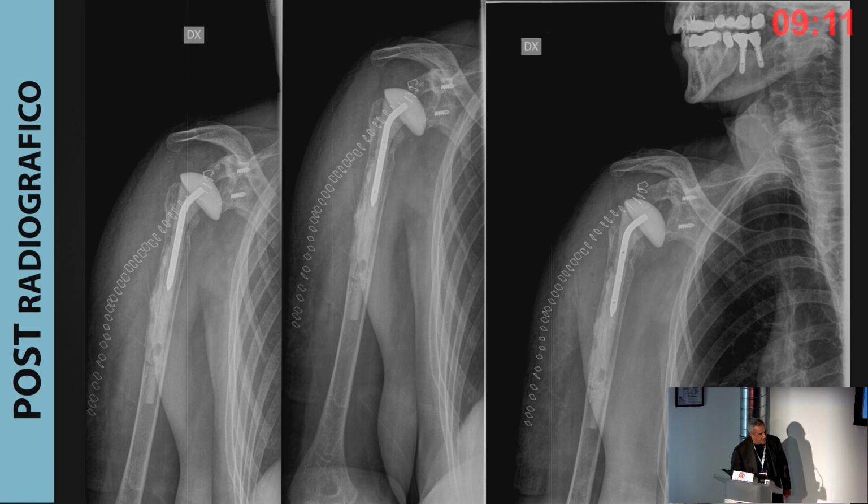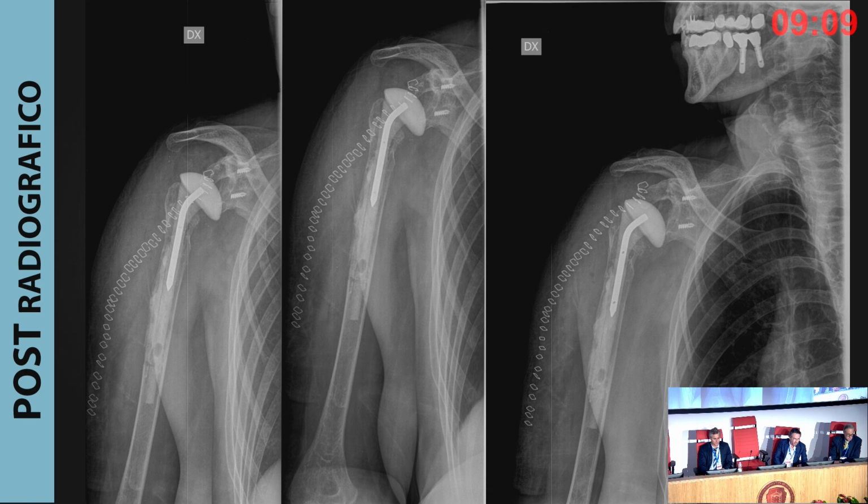Are you satisfied with this X-ray, or would you expect something different? I am extremely satisfied with this X-ray, especially because it's yours and your patient. But I think the spacer is in the perfect position. Thank you. I would have done the same with those screws for sure.